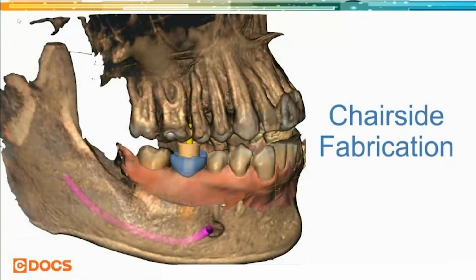So like I talked about at the beginning, by combining the cone beam and the CAD/CAM data, we can plan the placement of the implant in a restoratively driven process, and we can place the implant with a guided technique.